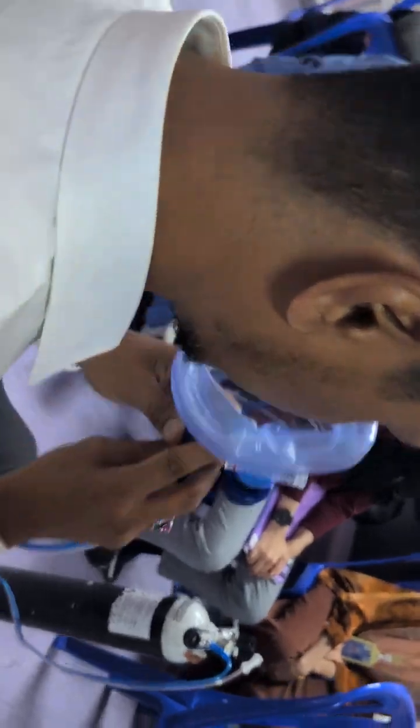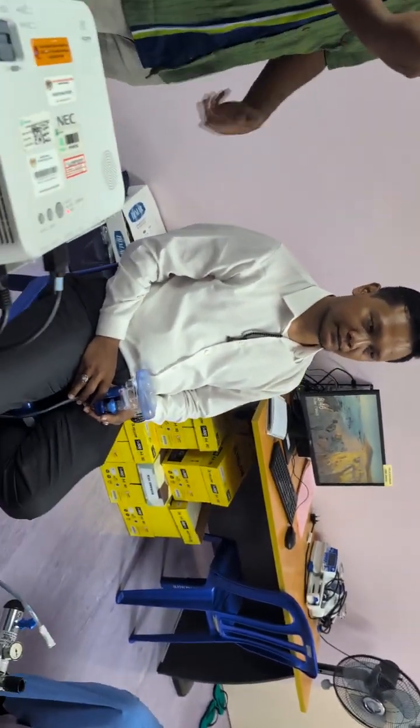So basically you need a double flow. Double flow meter? You got a double flow. Ada tu banyak, or through the wall lah. Dekat ni tak ada lah. Dekat ni tak ada. That is why for pre-hospital, there is no choice, we have to use one.